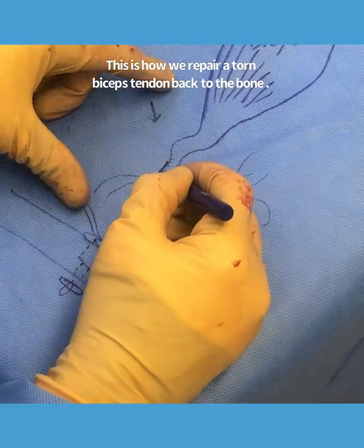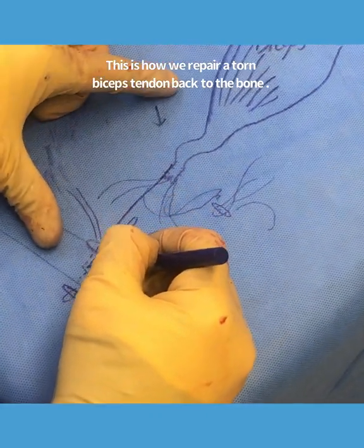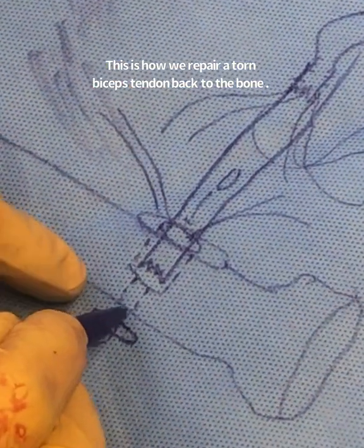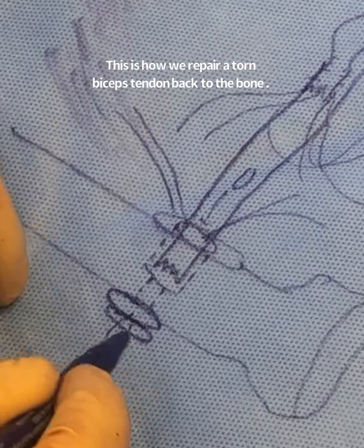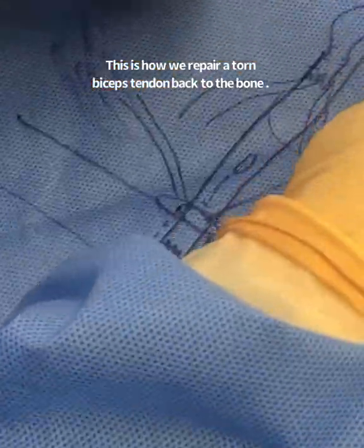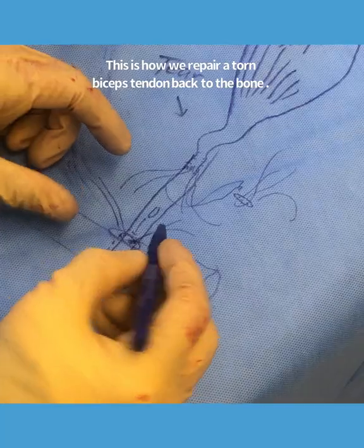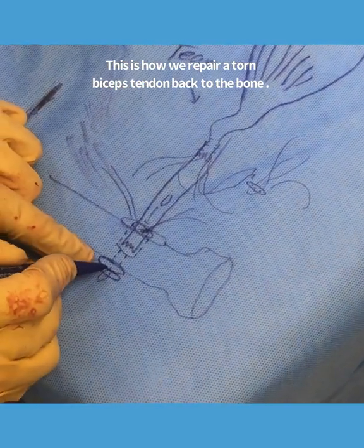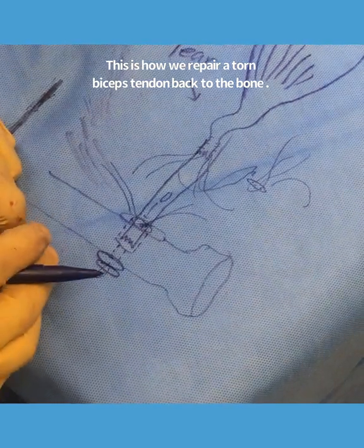As you pull those sutures, the tendon gets sucked into the bigger tunnel and this button then goes up against the cortex on the other side. It can't be pulled back, and once you pull really hard, you tie over here and you have a distal biceps repair with a single button on the opposite side that acts like a toggle bolt.